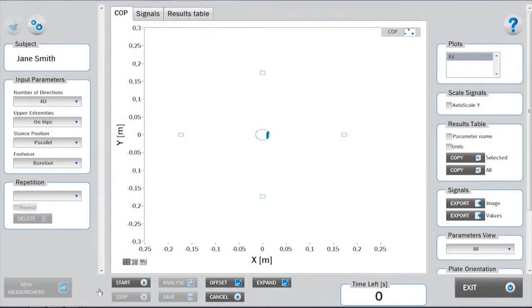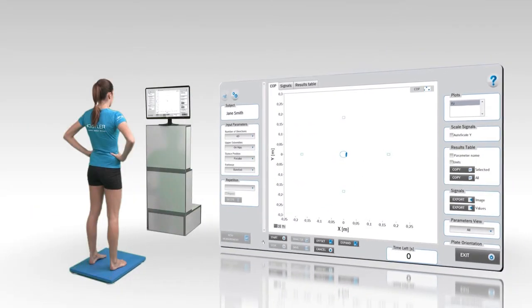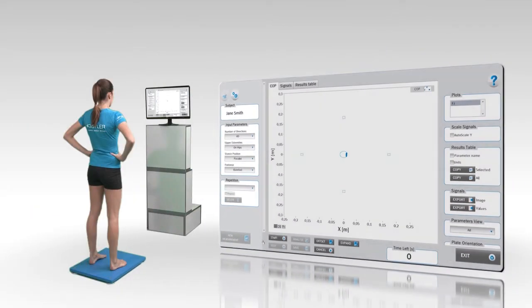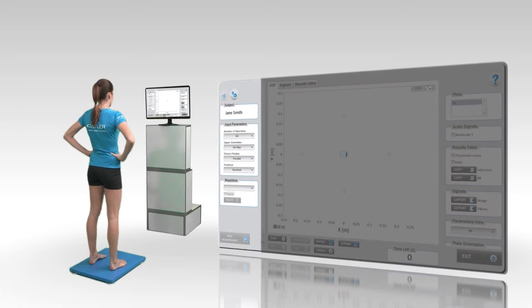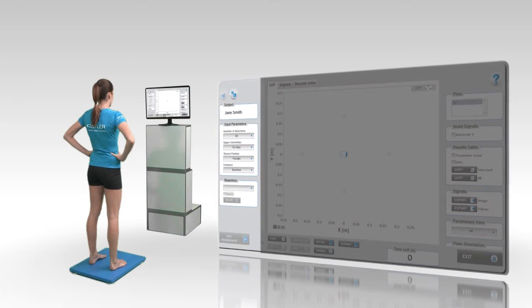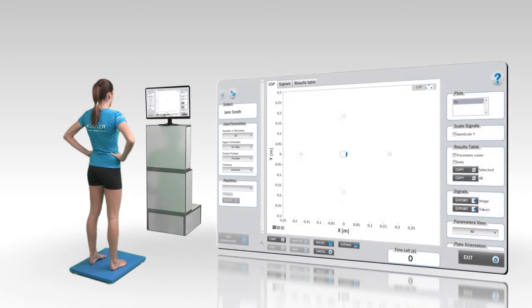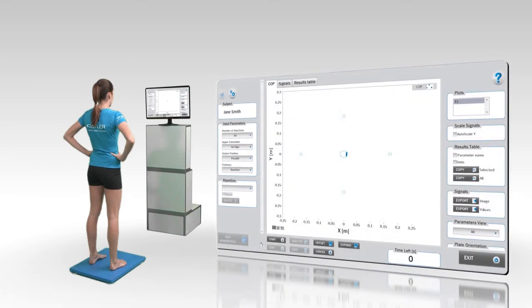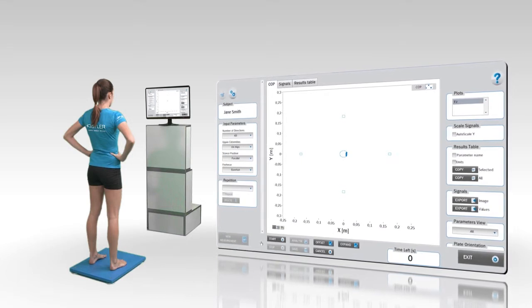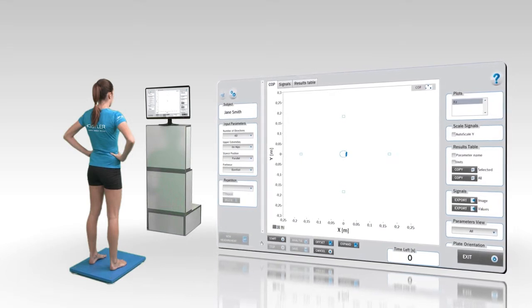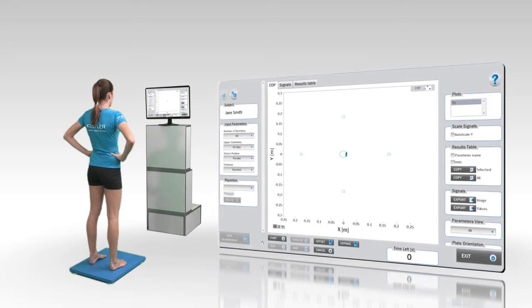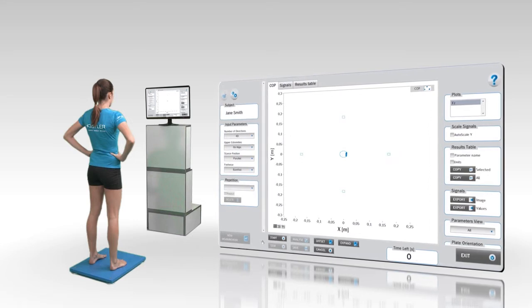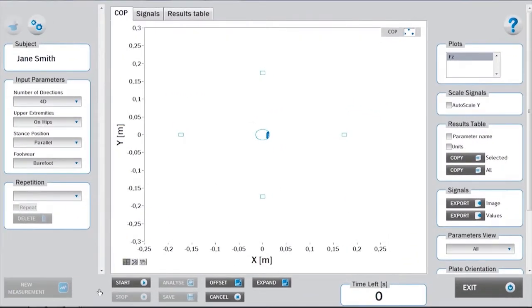Before starting with the measurements, the subject must assume an appropriate initial position, which is determined with the input parameters. The subject must place their focus on the computer screen. The goal of the task is to move the center of pressure against the marked spot on the screen as quickly as possible.